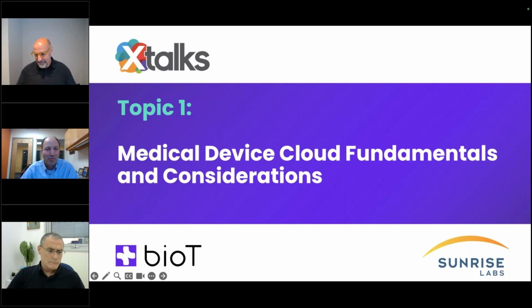Daniel covered some of the positives in terms of being connected. Like a clinician monitoring is just greatly enhanced, and then you have to balance that in a way that you have to design your user interface to be multidimensional. Like you've got a clinician interface, you've got a patient interface, and so those user interfaces can be further, better optimized for the different sets of users, and that's a good thing.